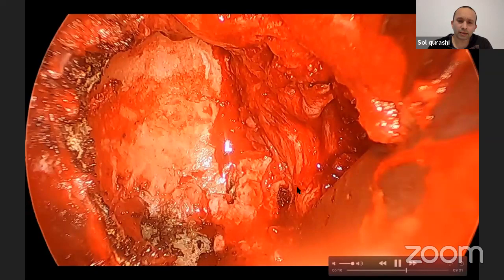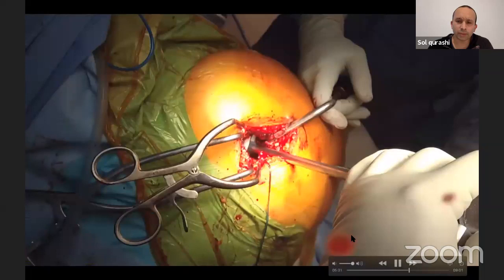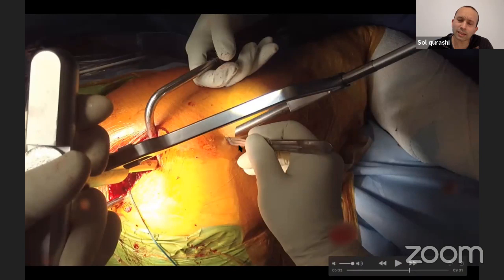A lot of times I don't use the femoral head. Now you put the cannula sort of posteriorly. Remember, looking at that, you think, oh, that's pretty close to the nerve. But when it goes in, it's at the level of the nerve. But by the time it gets to the femur, it's actually right next to the femur. And the trocar is blunt.